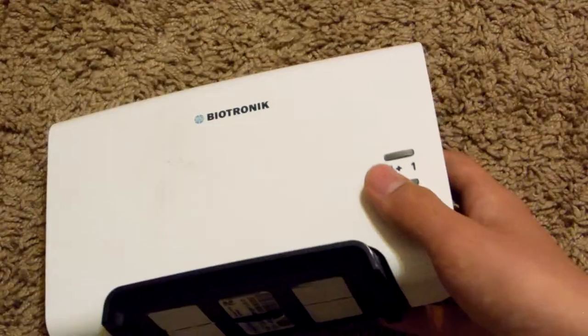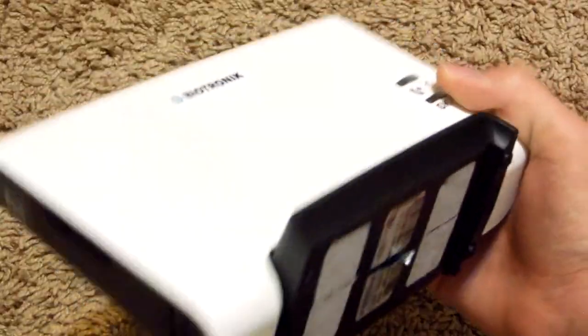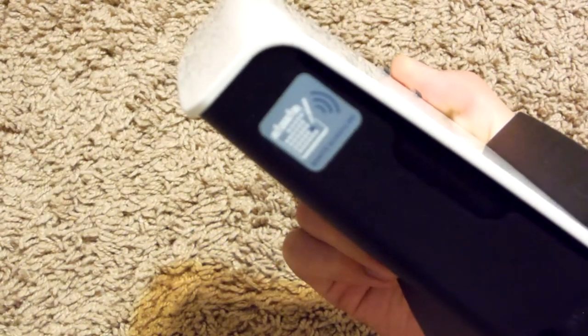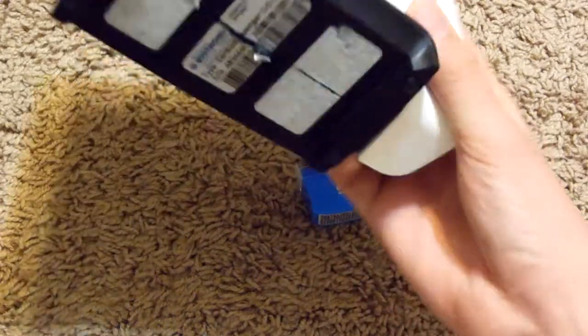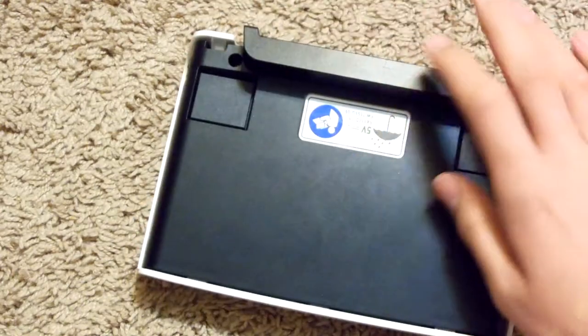I've already cut through the seals at the bottom, so we're ready to go. On the side you can see — it says 'remote scheduling' — which means this has a wireless module in it. This is just a stand I used to hold it up. So let's begin.